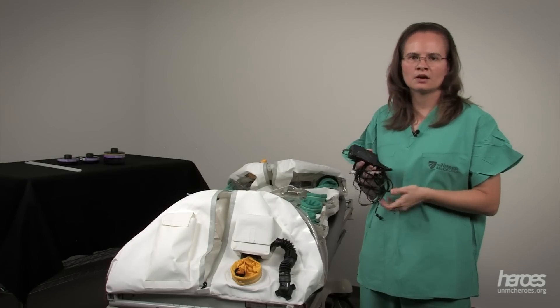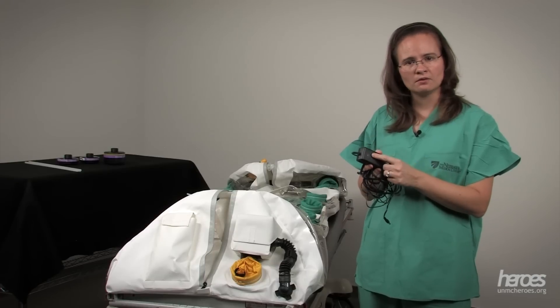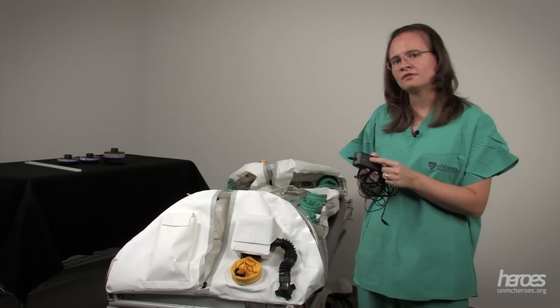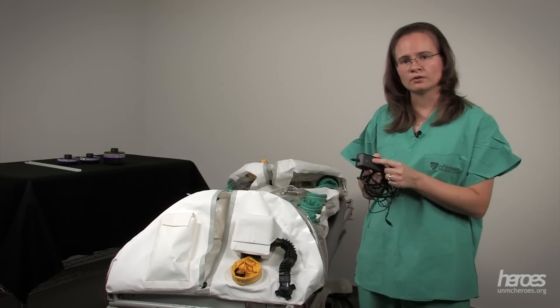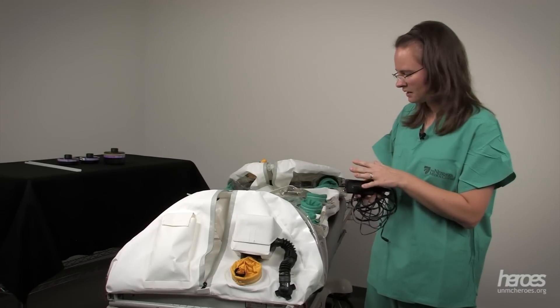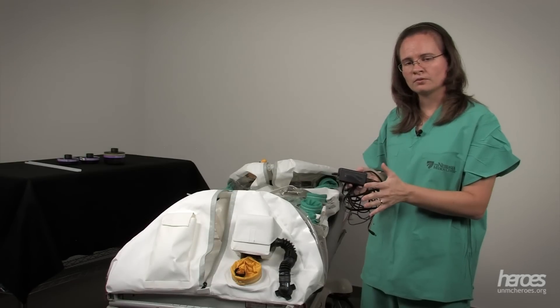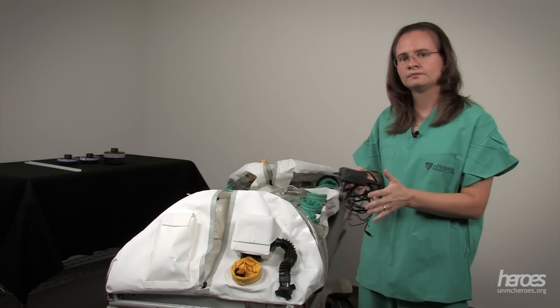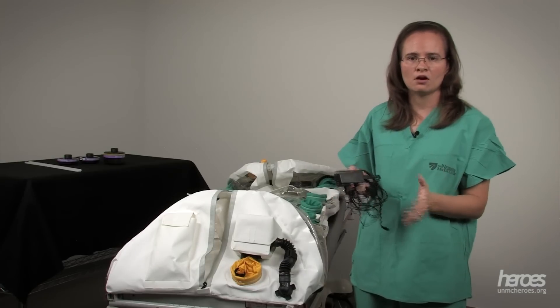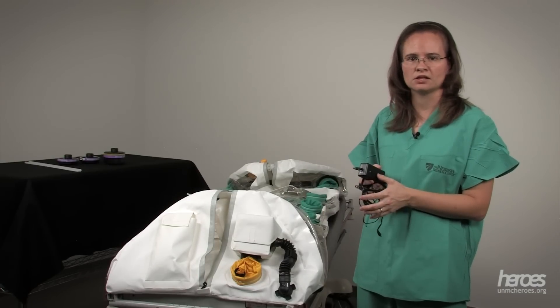The blower motor comes with a charger. The charger will be red when it's charging and turn green when it's fully charged. People often ask how long will the blower motor run. The best way to test this is to set up your isopod with all of its filters completely zipped up and run your blower motor with a full charge. Record the time that it lasts — this will tell you exactly how long your blower motor will run and how long you can trust it in a real situation.